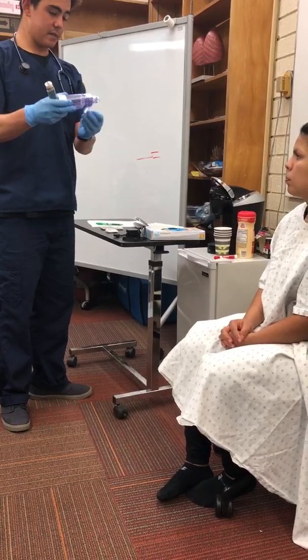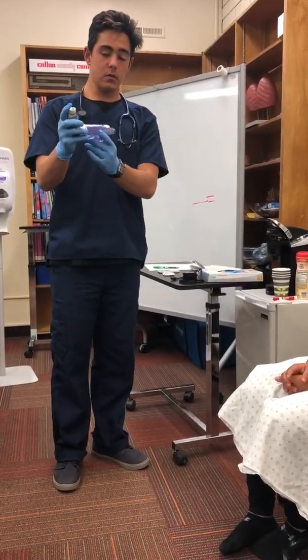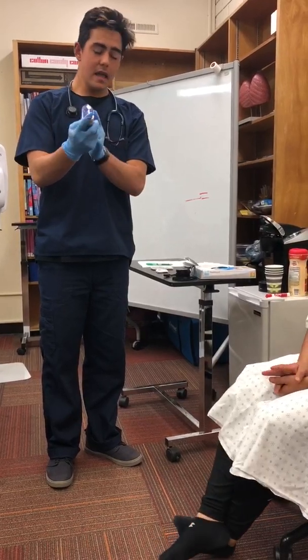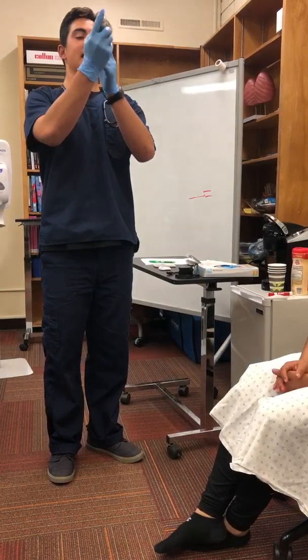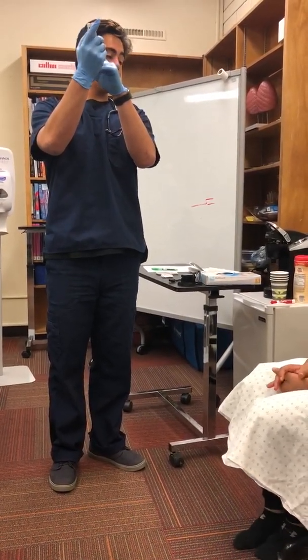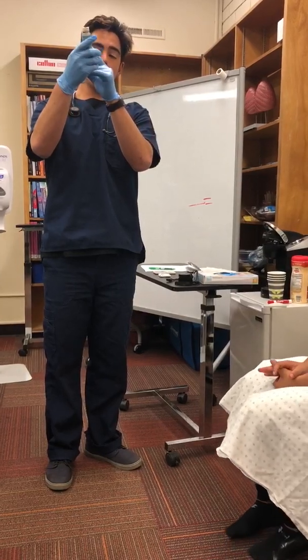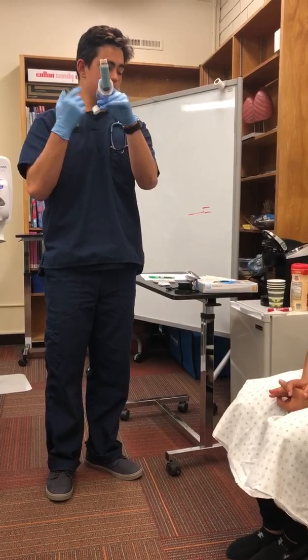We're going to uncap the mouthpiece. When we go ahead to inhale this, we're going to want to press the trigger, the actuator, at the same time that we're breathing in, okay? So we're going to sit upright, head slightly back, and hold the mouthpiece in our teeth, lightly gripping the tip of it, as well as pursing our lips over the top so that it deposits into our throat and lungs and not onto our teeth.